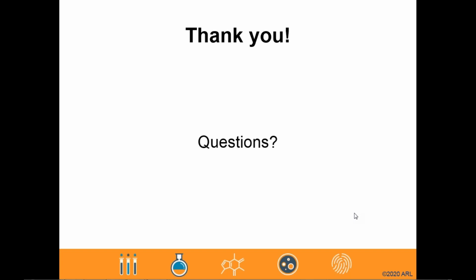Next question: growth-based rapid sterility tests utilize a 2 to 3 day incubation period? That can vary based on method and also based on that individual facility's validation protocol. So one can imagine if somebody designed a validation protocol to only use healthy organisms at relatively high CFU counts, say 100 CFU or even less than 100 CFU but greater than 10, 2 to 3 days would probably be plenty, frankly, with a healthy organism.